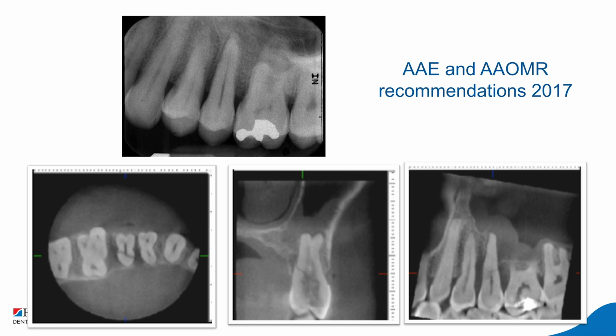And again, that is the recommendation here from the American Association of Endodontists, where you see on the superior aspect of the screen, on that PA, tooth number 13 was symptomatic, and you can't see anything that goes wrong on that tooth. You would probably go ahead and start the root canal therapy, but a 3-dimension view was made of the area, and you can see that tooth number 13 demonstrates, in fact, some serious issues.